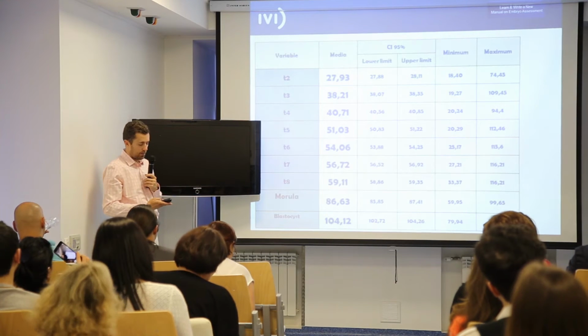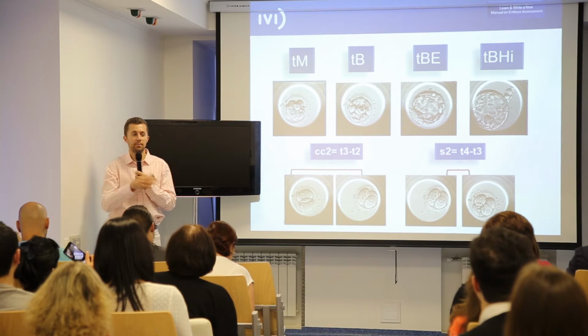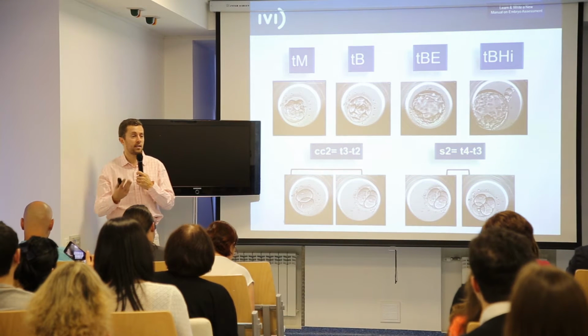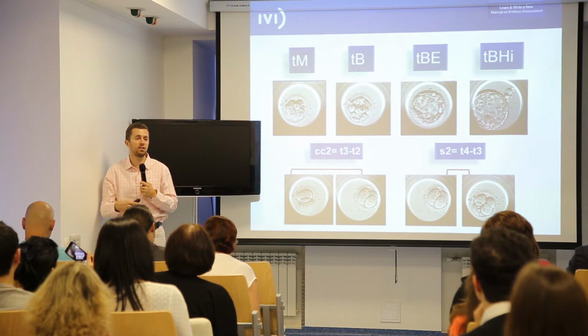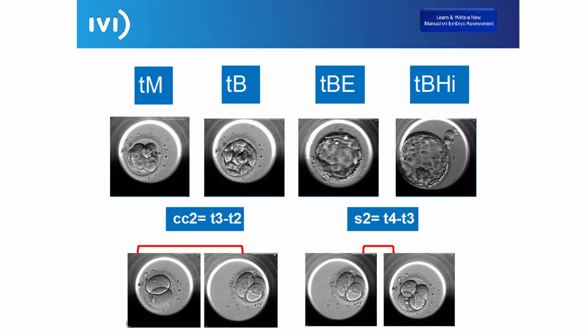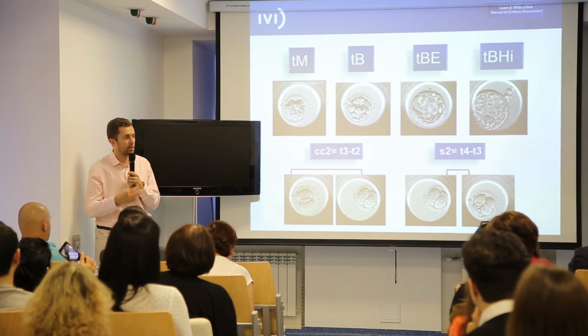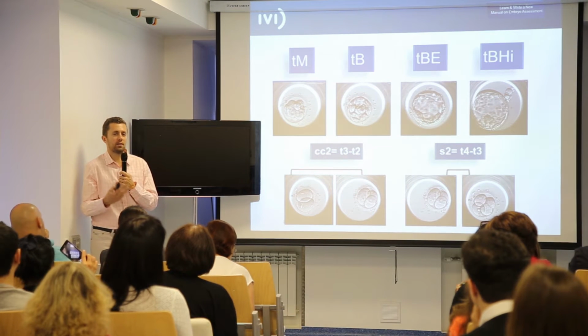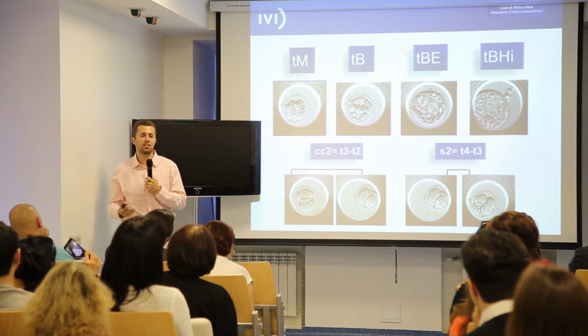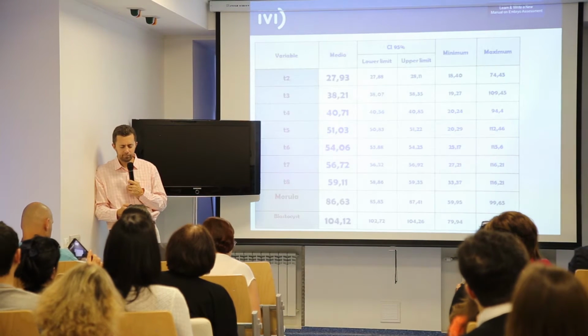Also, the blastomeres are connected between them, and they should keep the same time. We must expect that the embryos are synchronized, that all the blastomeres are synchronized. And if there is any asynchrony between the blastomeres, we must expect that the communication between them is failing somehow, and there is something wrong in the machinery of the embryo, and that can be potentially affecting development.